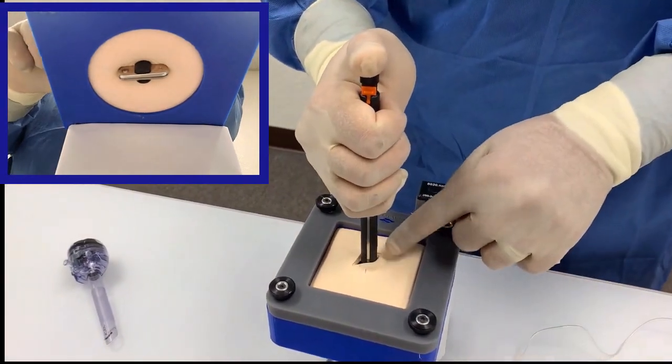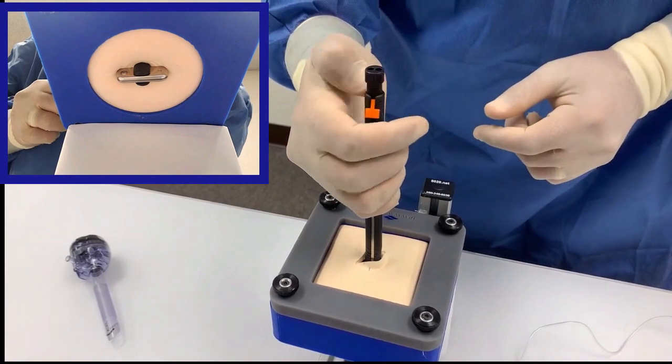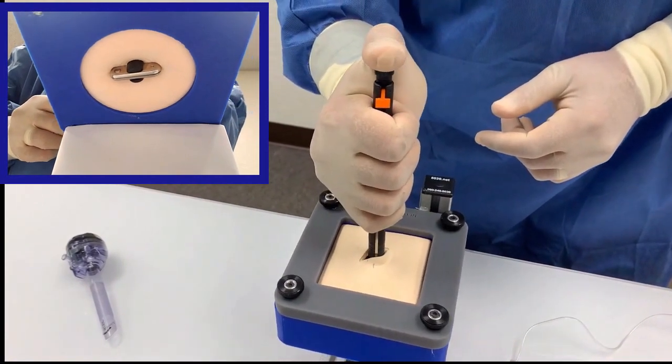Confirm the white line is at or below the skin. Flip down the orange clip and press the plunger all the way down firmly.